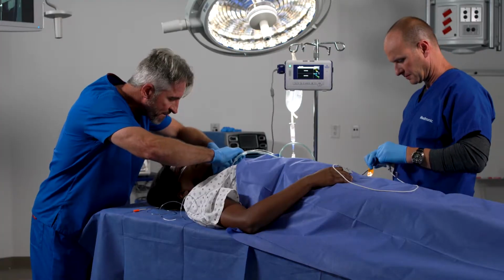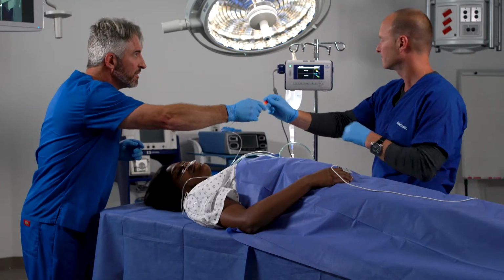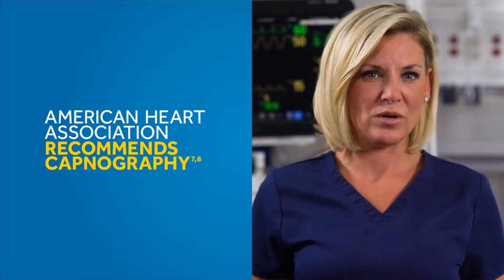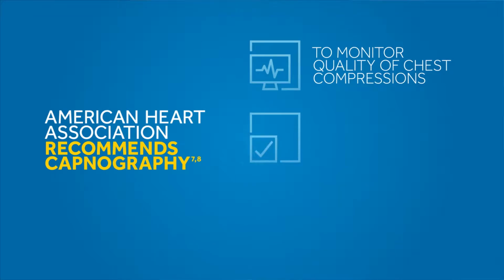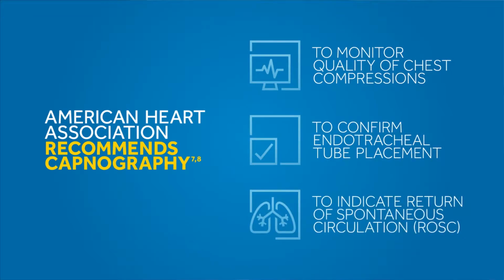In the hospital setting, capnography is used across many areas of care for both intubated and non-intubated patients. It works for virtually all patient populations, from neonate to adult. The American Heart Association issued guidelines calling for capnography monitoring to help clinicians monitor the quality of chest compressions, to confirm endotracheal tube placement, and to utilize as an early indicator of the return of spontaneous circulation.